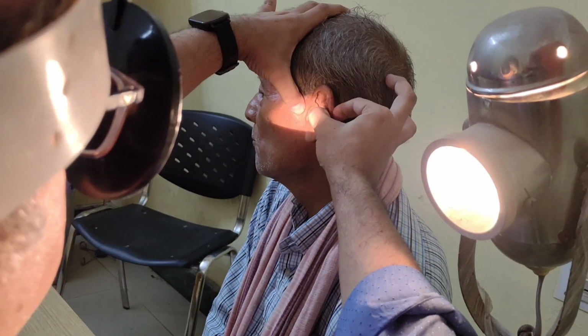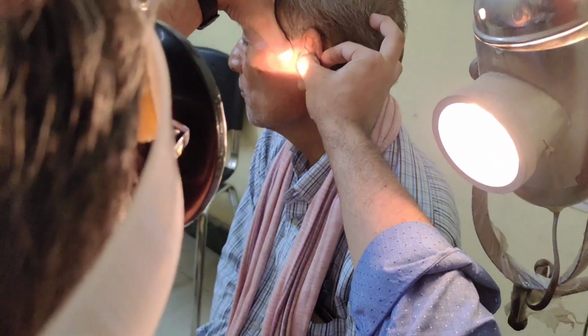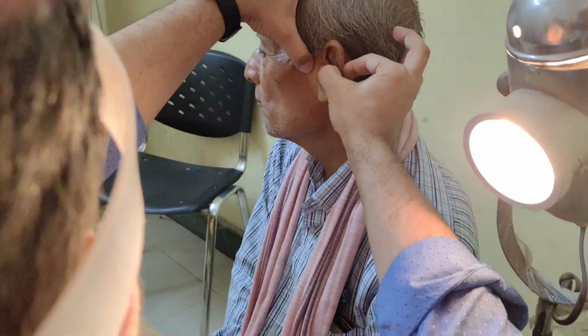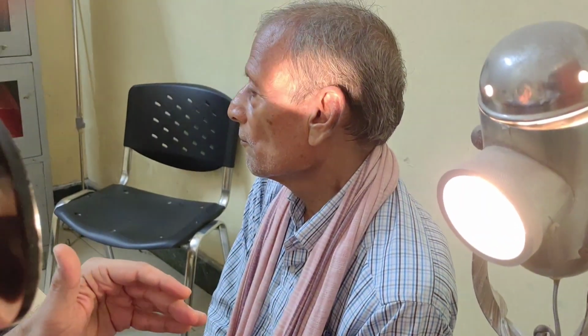It means the same. So you straighten the cartilaginous part of the external auditory canal and you inspect the external auditory canal without the speculum, and you see the outer cartilaginous part for any debris, wax, foreign body or any sinus or fistula there, or any scar mark there.